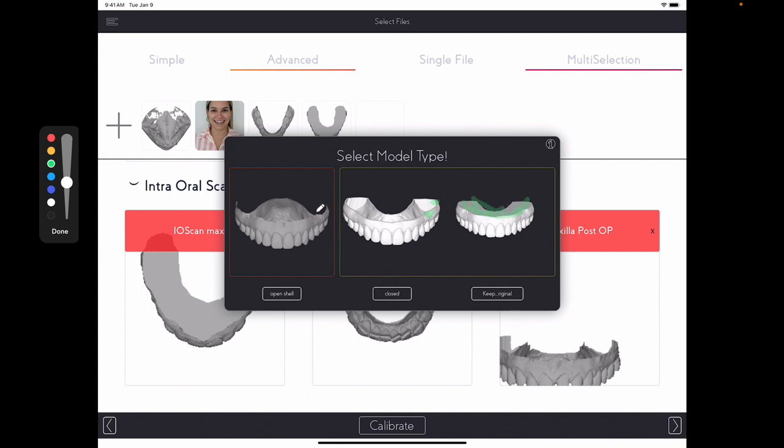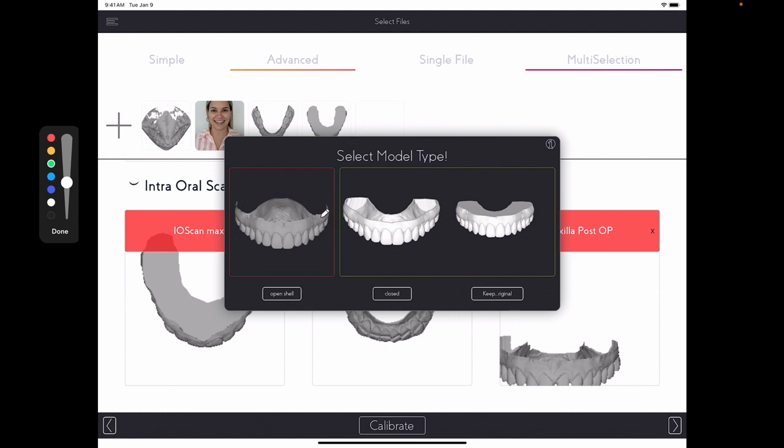If it's not closed, let's say you just exported the file from your intra-oral scanner, it will most likely look like this. It's very thin, as you can see. Basically, you will not be able to 3D print the model after you design. So if it looks like this, simply click Open Shell.